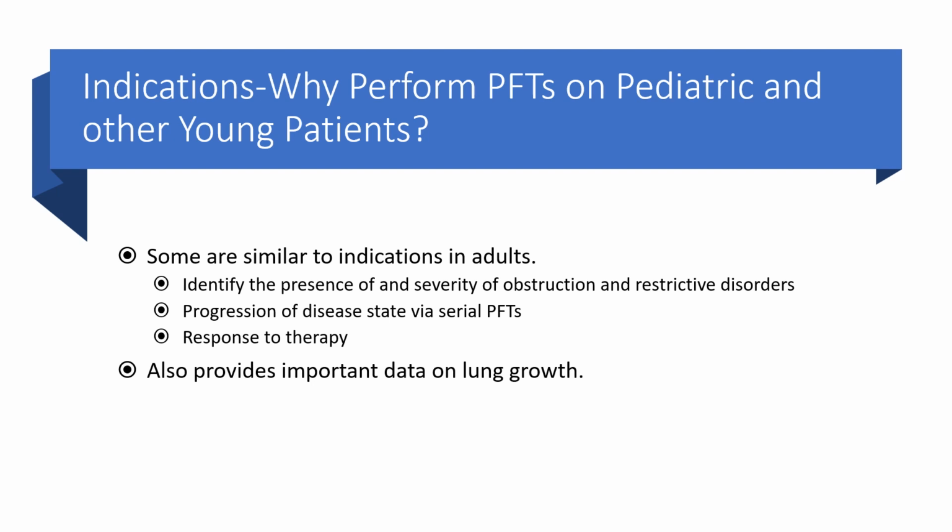We're also trying to monitor the progression of the disease state by performing serial pulmonary function tests, so over a series of months or years. This can be particularly useful in tracking the effectiveness of the treatment plan and, unfortunately, the progression of the disease in diseases such as cystic fibrosis. Look at the response to therapy, and in some cases, if that cystic fibrosis patient is holding their own, they're really complying with the care plan, their deterioration may be very, very gradual.